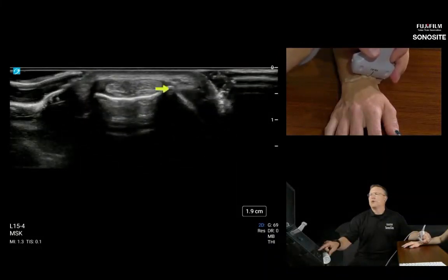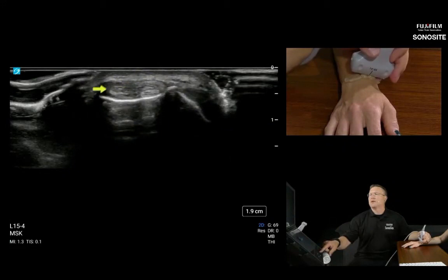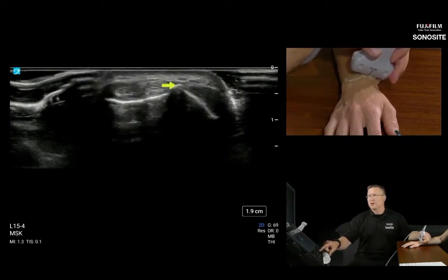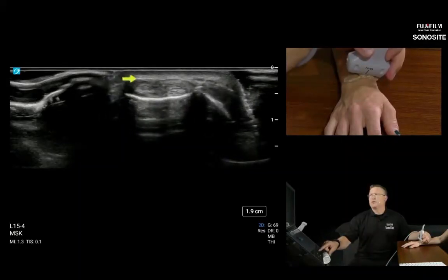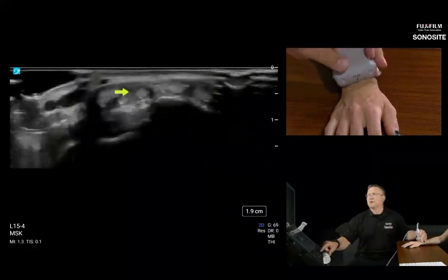And remember those bony prominences that tell us where the individual compartment retinaculums begin and end, right here. So we see a little bony prominence on the radius here, and it's pretty smooth in the compartment. And then the more dorsal we go, we see another bony prominence here, which is the insertion of this retinaculum, this dark shadow. And that's compartment number 2.